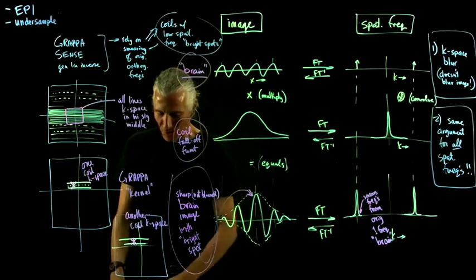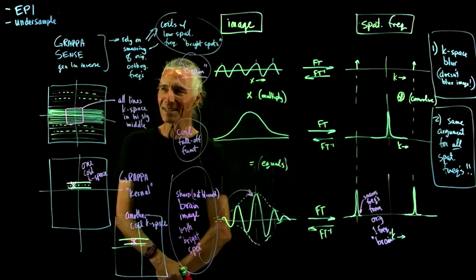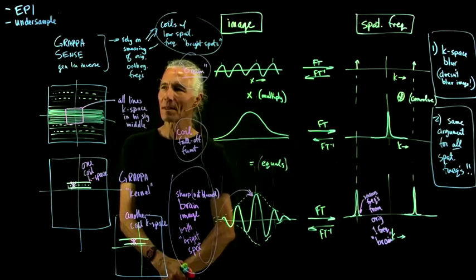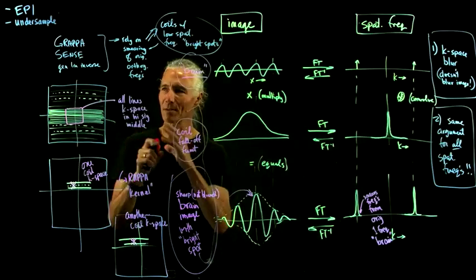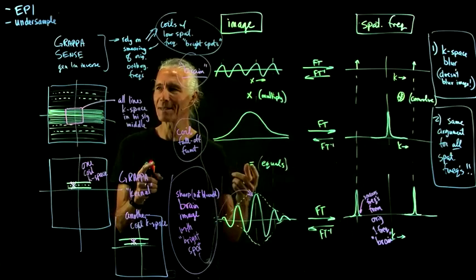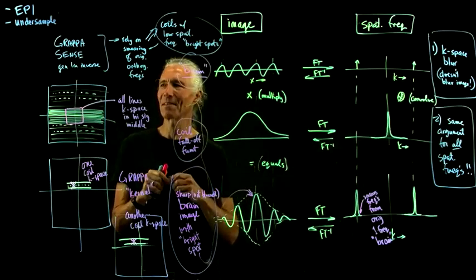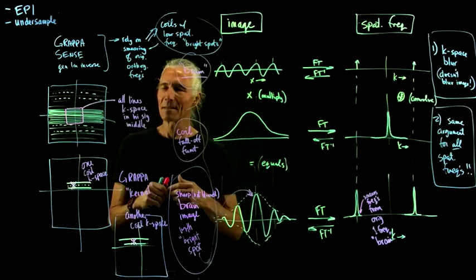Okay, so if you go and try to read a paper on GRAPPA, you'll see it can be a little confusing, but now this is widely used. Every single day at the scanner, we do an MPRAGE with GRAPPA turned on, and only record half of the data. And that's a big difference, because now we get a scan in 5 minutes that used to take 10 minutes, and it looks ever so slightly noisier, but basically it's just fine. And so it's like overnight, we just doubled the rate of collecting data. So it's a big effect.